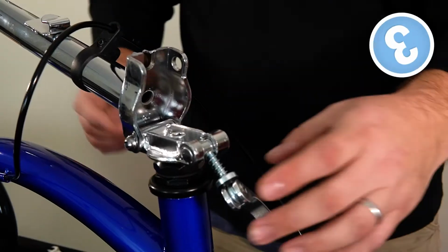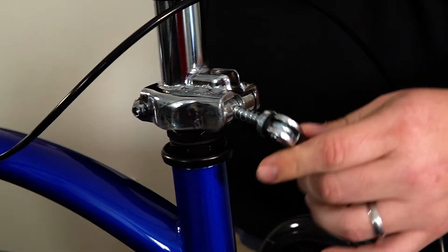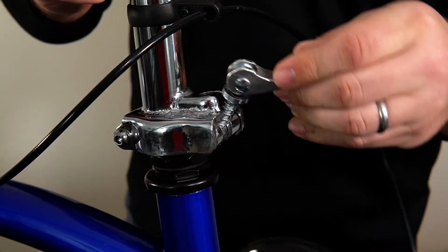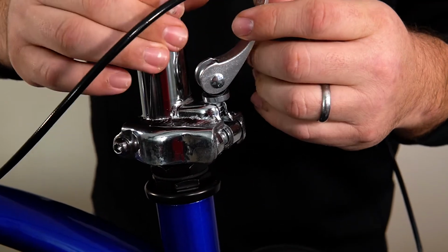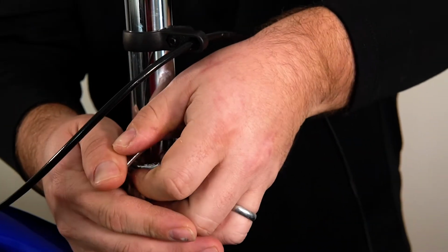All right, so step 3, we're going to fold the steering column up. And what I did there is I pinched that lever over. You're going to rotate this lever upwards. You may have to move this cable up. And then you're going to clamp it down.